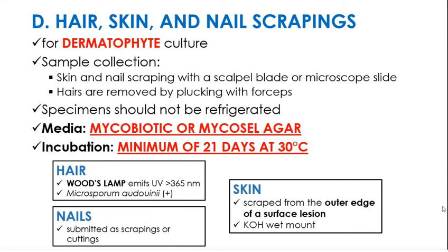Pag hair naman, pwedeng i-cut yan ng sterile scissors, but the best one is still plucking with forceps. Of course, sterile din yung forceps mo. Now, for hair, skin, and nails, hindi kailangan ito ilagay sa refrigerator. So, ano ang gagamitin nating media when you have your pinagsama yung skin and hair?